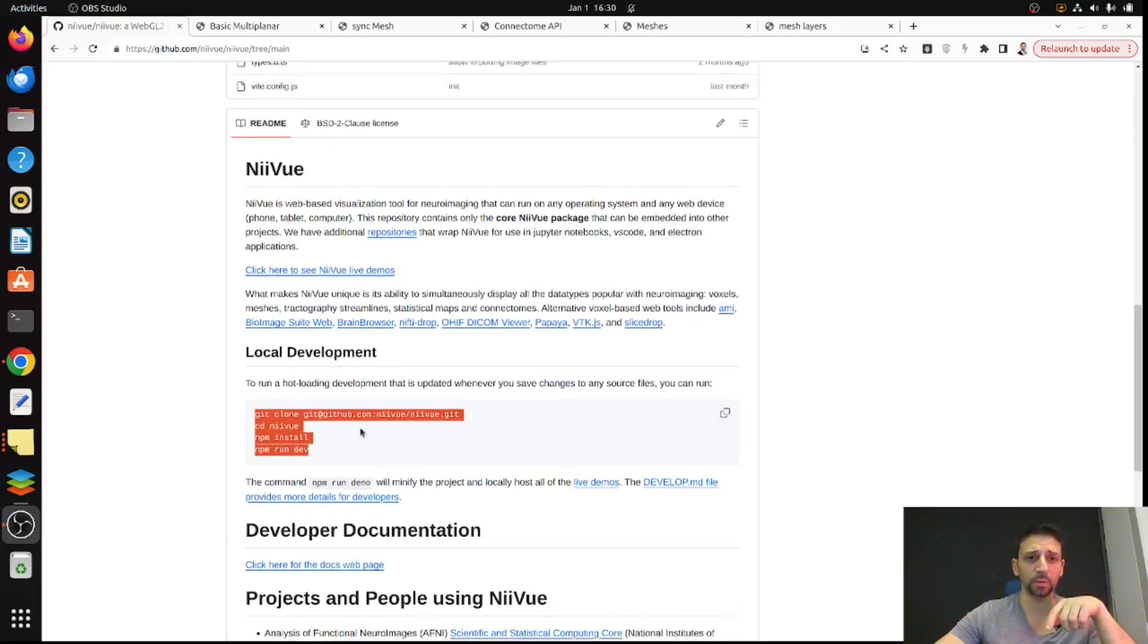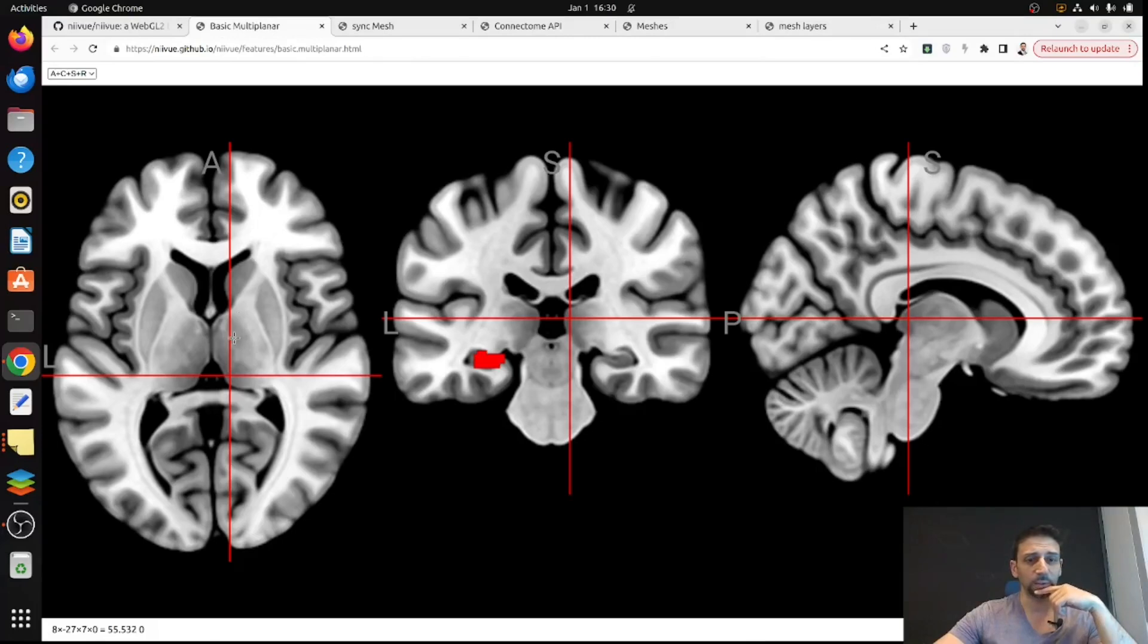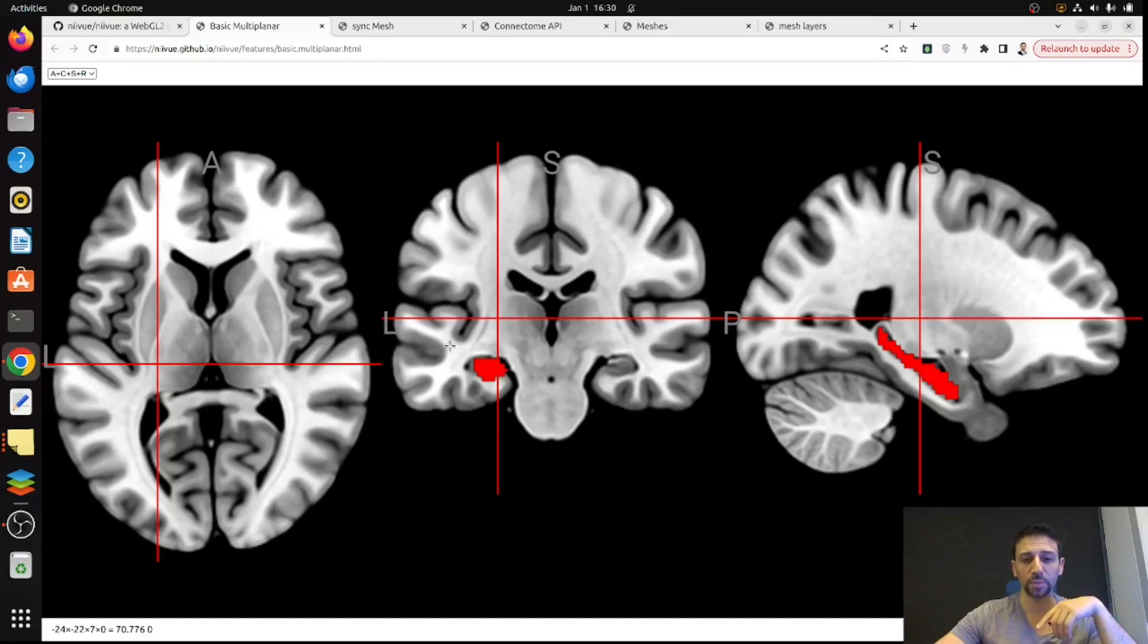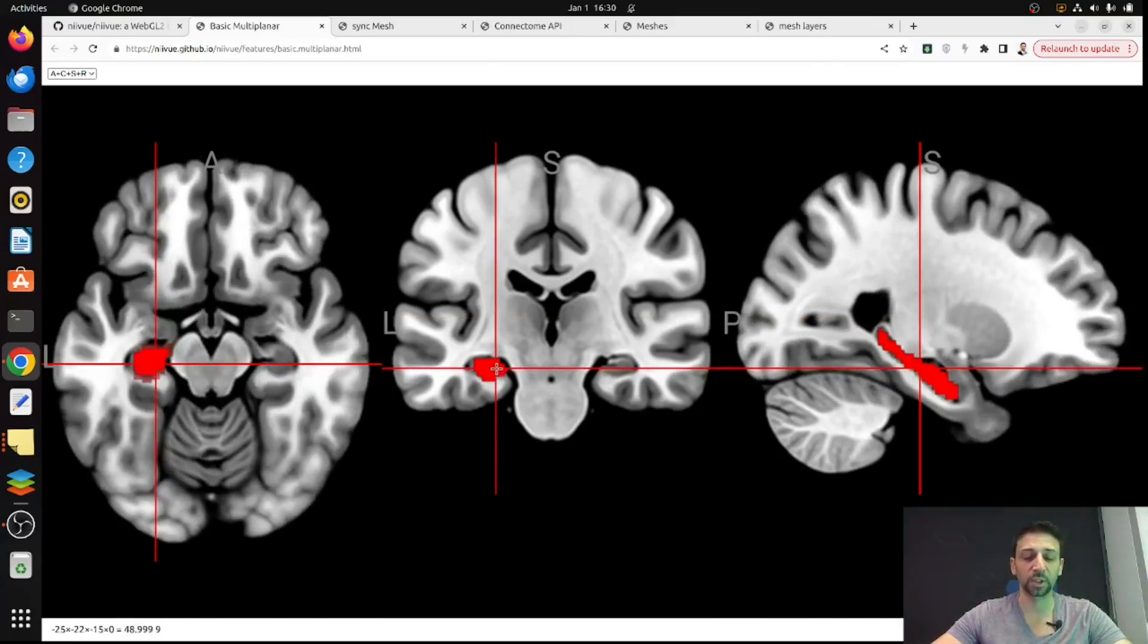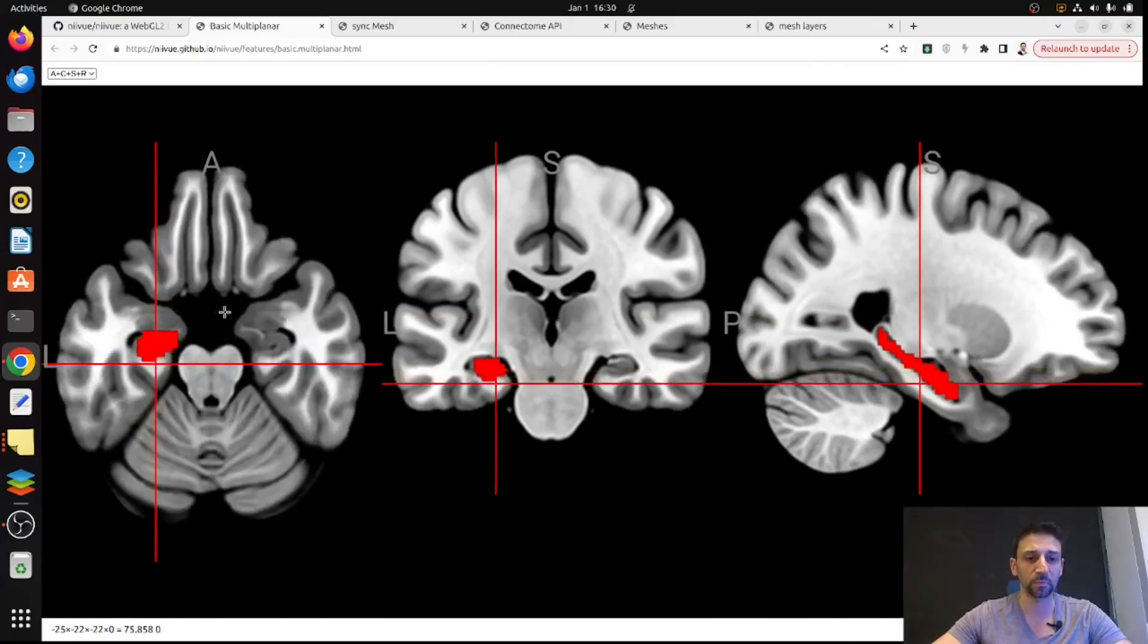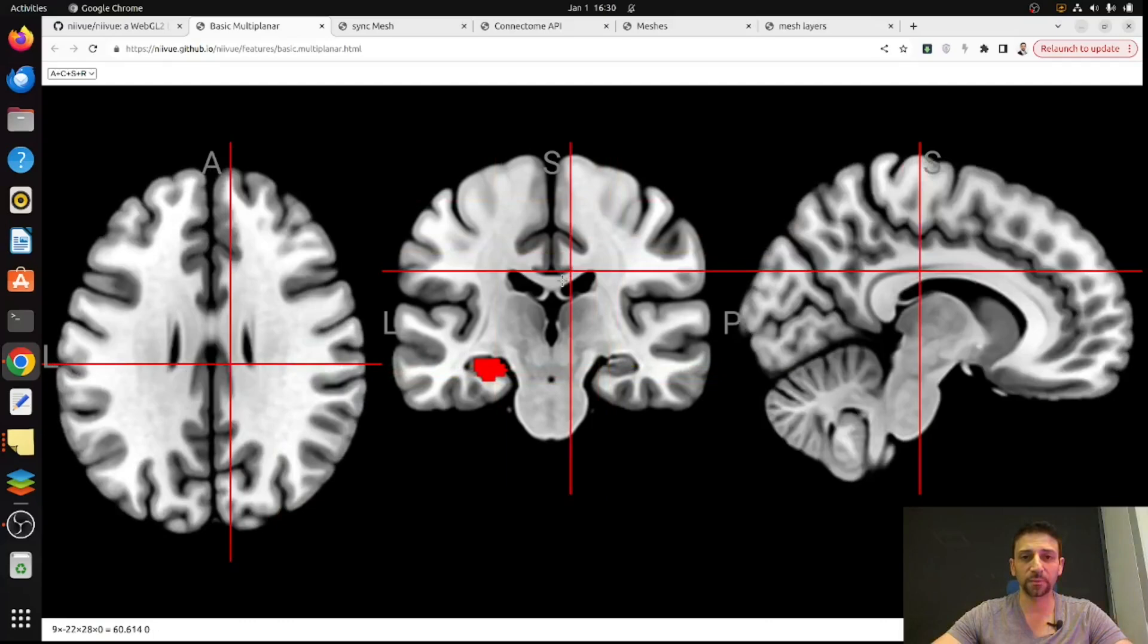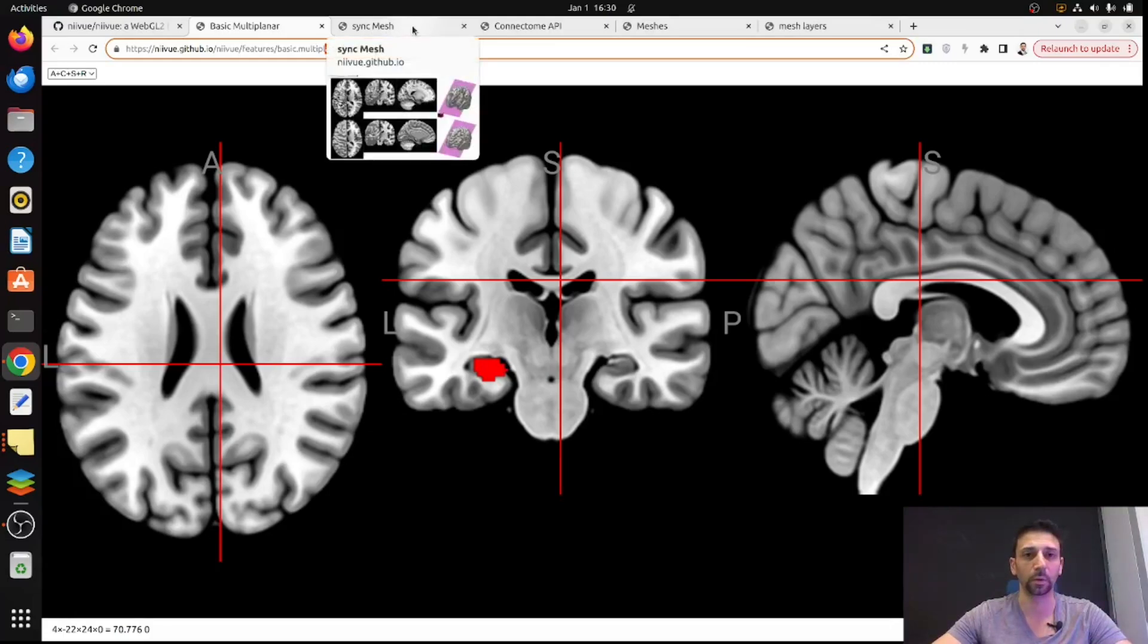In the repository you can find some nice demos. For example, this is the first one I found, essentially loading some Nifty files, both like an atlas and also some kind of segmentation of the hippocampus. You can see it's very fast and very smooth, running directly in HTML5 either locally or on a domain.